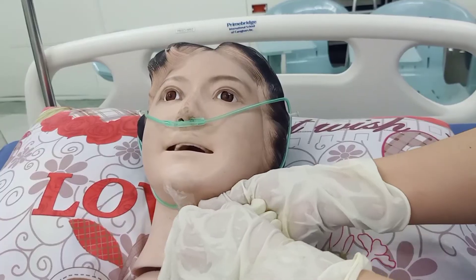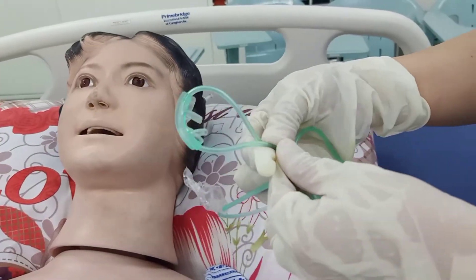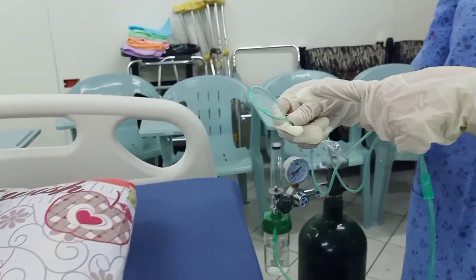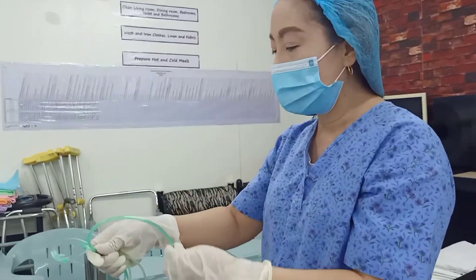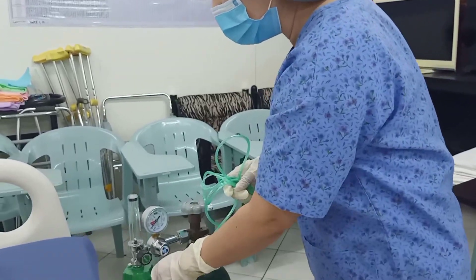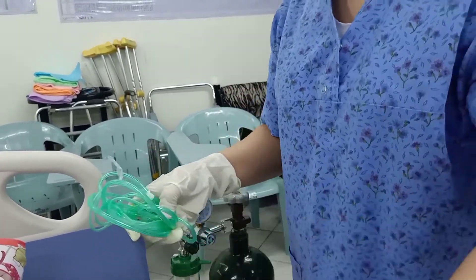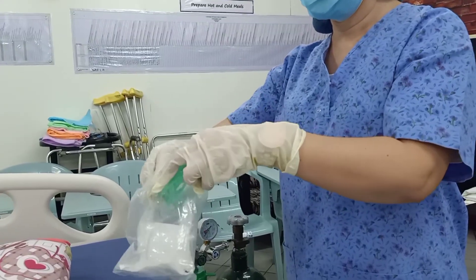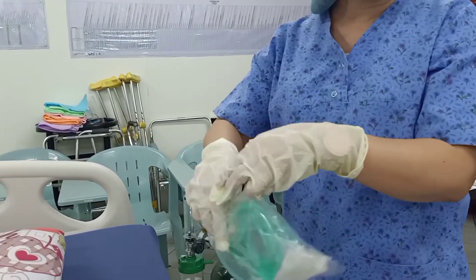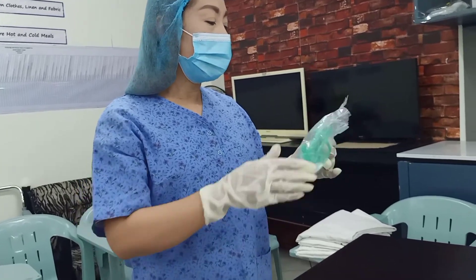Loosen the nasal cannula. Make sure that nothing touches the portion of the cannula that was in contact with the patient, because it is contaminated after use. Roll it, remove it from the connector, and dispose of it. Do the double bagging and throw it into the yellow contaminated trash bin. That's all for today. Thank you.